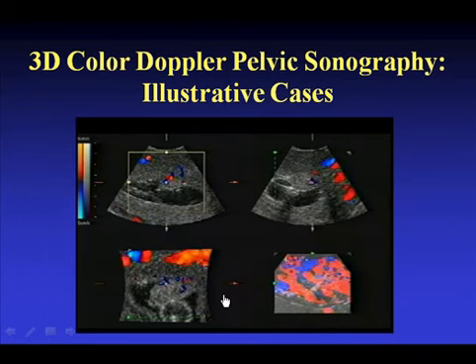So the polyp and its vascularity are seen very nicely with this technique.